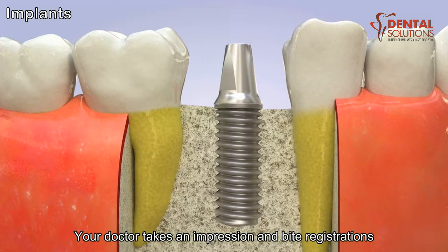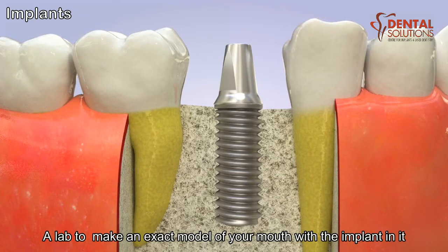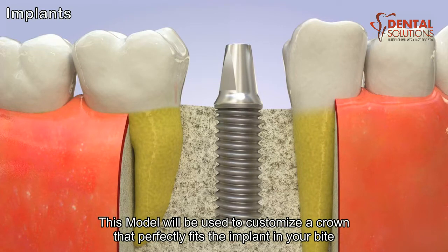Your doctor takes an impression and bite registrations, which will be sent to a lab. A lab will make an exact model of your mouth with the implant in it. This model will be used to customize a crown that perfectly fits the implant and your bite.